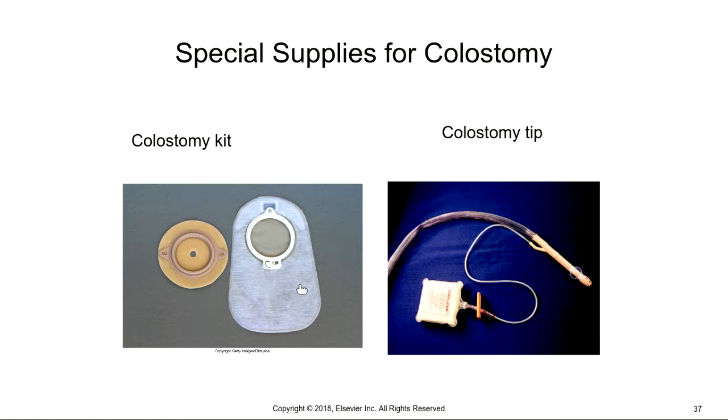Now, I have met a lot of patients that do a good job at keeping the odor down, but most of the time these patients tend to be elderly, and caregivers are elderly, like a little old husband and wife. So it's hard for them to clean these. There's typically a lot of accidents with these because of where they place the stoma. It's usually above the waistline of the pant, so that this bag hangs over the pant. And imagine the seal on this is good but not the greatest.